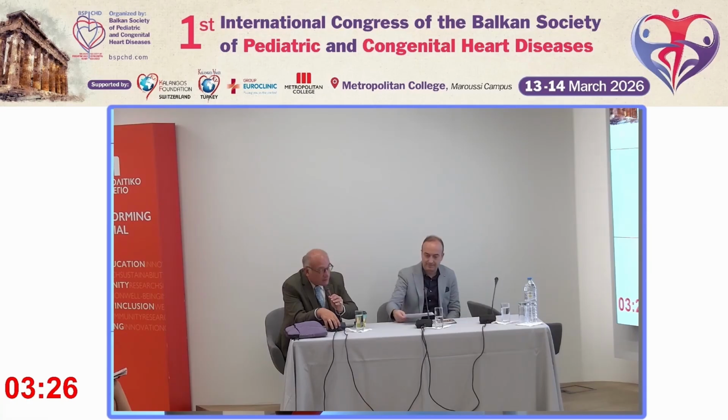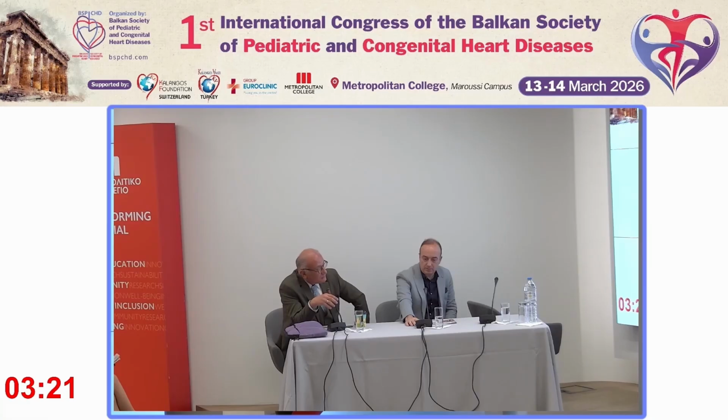Dr. Kamperou, for this presentation. I will not wait for the end of the session to ask you this question, because sometimes, especially in some morphologically complex mitral valve abnormalities, I have the impression that the cardiac MRI is not enough. Do you believe that, especially in those cases, we have to combine the cardiac MRI with a 3D or 4D cardiac CT scan, in order to reinforce the accuracy of the imaging?